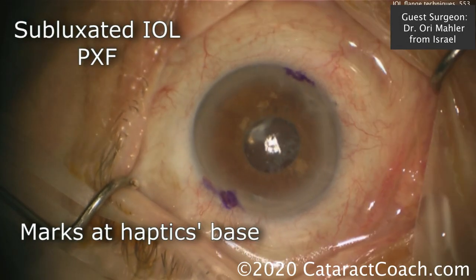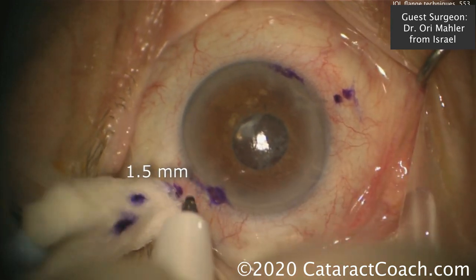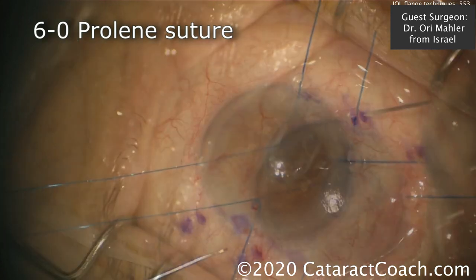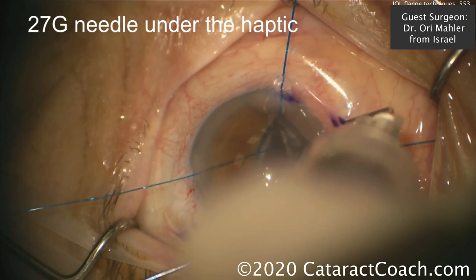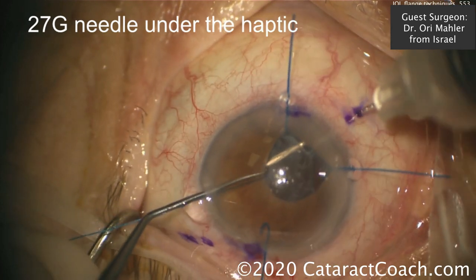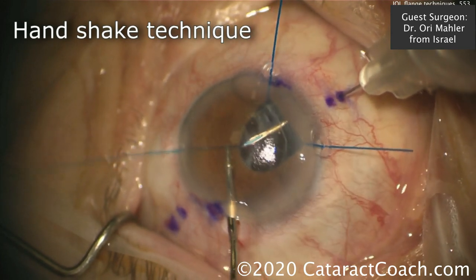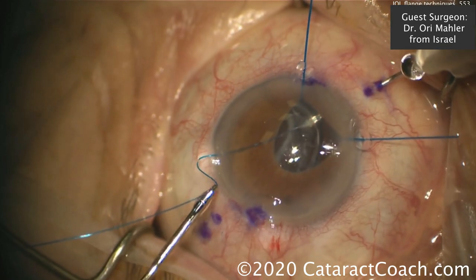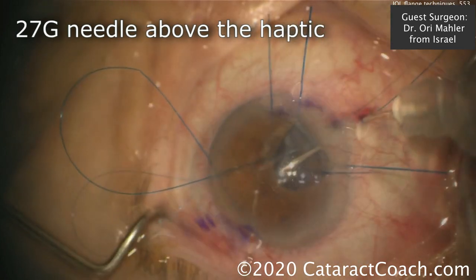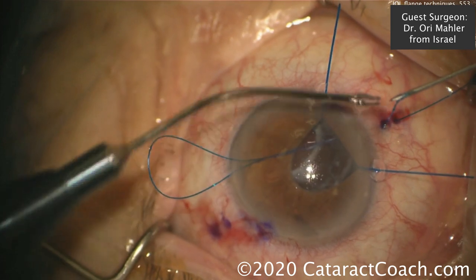That looks great. Next case: a subluxated IOL in pseudoexfoliation — surgery was done years ago. He's marking where the haptics are, placing two dots about 1.5 to 2 millimeters posterior to the limbal edge, then placing iris hooks to improve visibility. Using a 6-0 prolene, first placing the 27-gauge needle under the haptic. One end of the 6-0 prolene is threaded through there — using forceps to gently feed it inside the bore of the 27-gauge needle. That'll be pulled through using that handshake technique of the left hand feeding into the right hand. Pull the needle out and you've got one end of the prolene. The goal is to create a loop around the haptic, so the next pass is the 27-gauge needle above the haptic — one end below, one above. When you pull that through, it'll secure the haptic very nicely against the scleral wall.